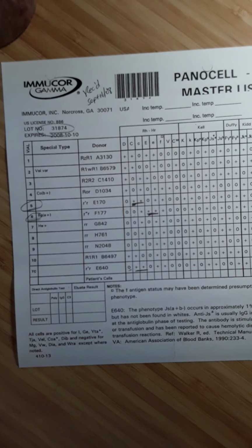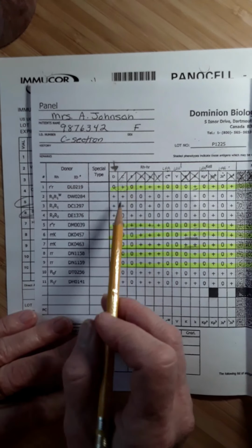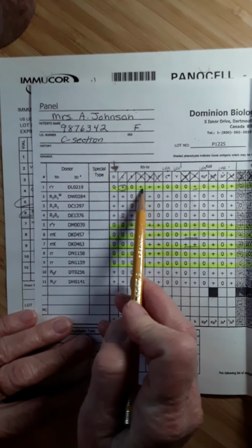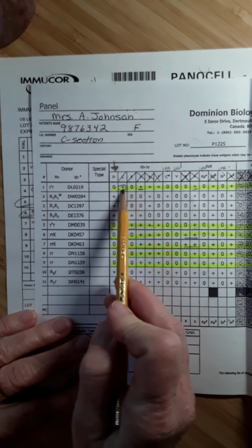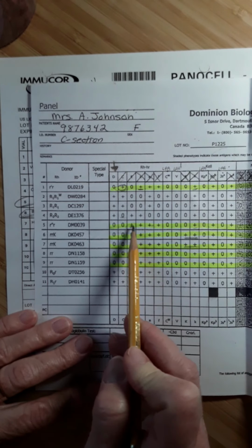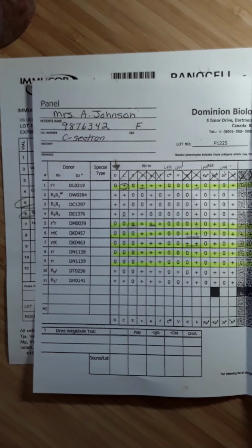Now, if you recall in the first panel, we did obtain this 1 slash for big C, and it was because we had a C positive cell that did not react, and it was hetero, and my E positive cell that did not react, it was hetero. So I have not achieved my rule of finding homozygous cells to help me do my excluding.